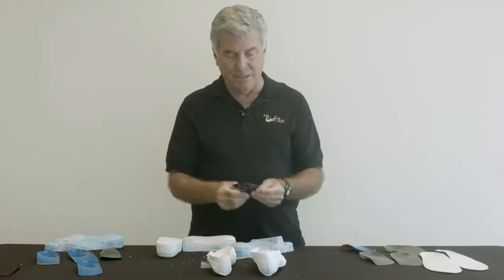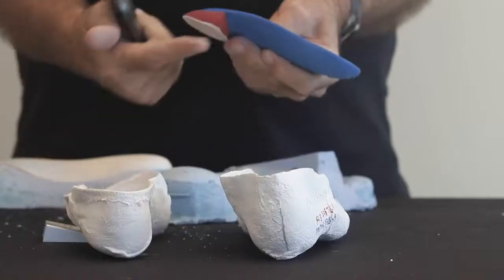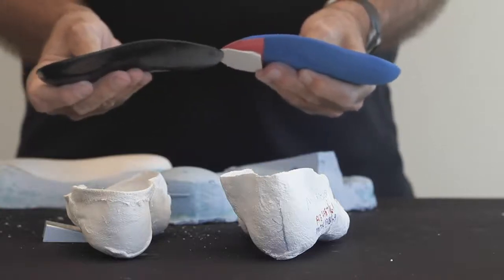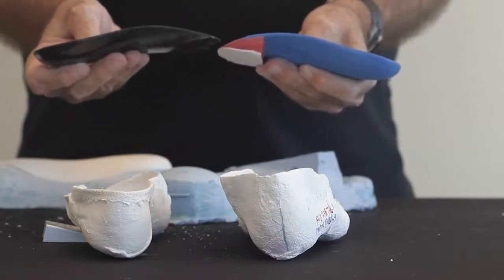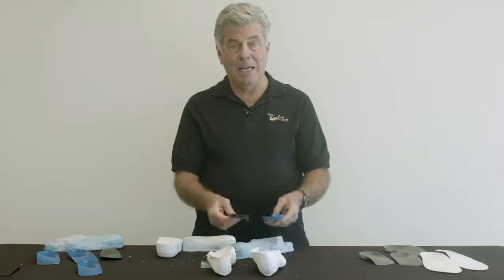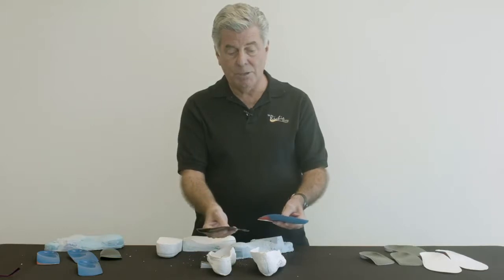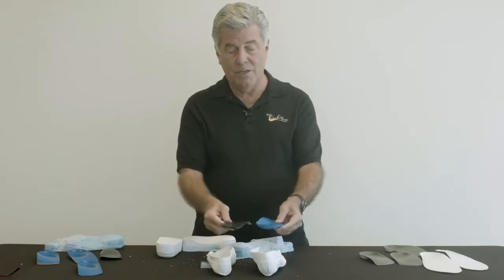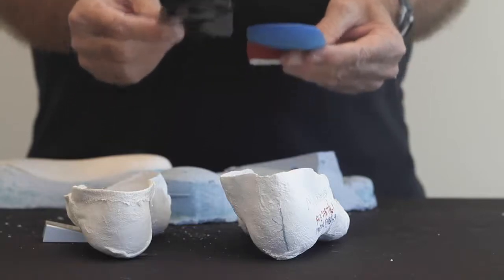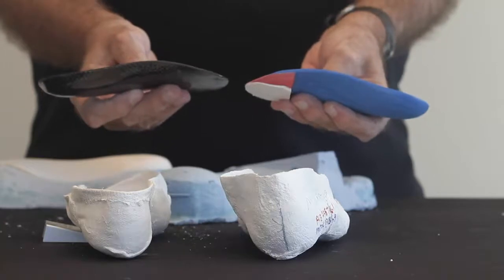Intrinsically balanced foot orthoses have the advantage of no bulk in the forefoot. We don't have this bulky post, so they may fit into the shoe a little better, and they're going to be a little lighter. The correction we attain with an intrinsic post or an extrinsic post is identical — the overall alignment of the heel to the ground is dictated by either method of posting.